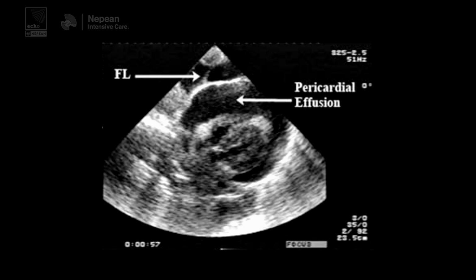And as I think you were going to say there, Chris, the thing to notice is that falciform ligament, which you see a lot, and that helps you a lot. And you can obviously see the parietal pericardium there as well, the big bright structure. And clearly there's a pericardial effusion here as well, which makes it easy. But it's important to think, is this definitely pericardial if you see something in the subcostal window? Because I've seen cases where you don't have that pericardial effusion and people have reported ascitic fluid as pericardial fluid. For sure.